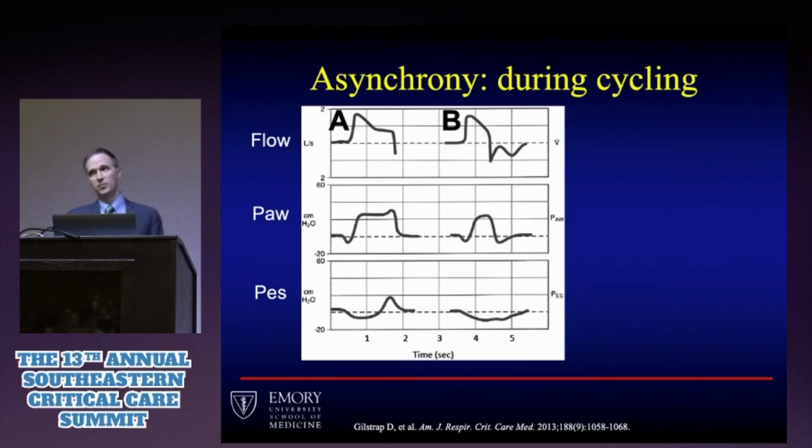Asynchrony during cycling can be really hard to pick up. I think the esophageal pressure balloon would be especially helpful in that scenario, but it's not often available. Essentially, a patient is done with the mechanically delivered breath and is about to exhale, either they've gotten too much and want to stop the breath early, or they want more, and the ventilator switches to the exhalation mode and they continue to pull. That will sometimes pull a second breath and result in that double triggering. And that's called cycling dyssynchrony.